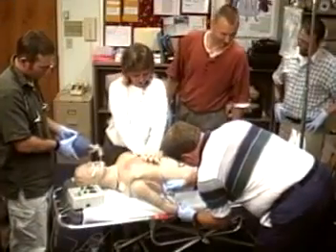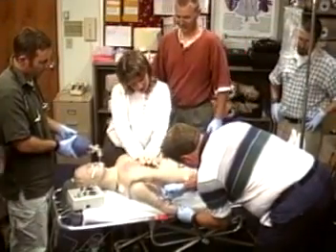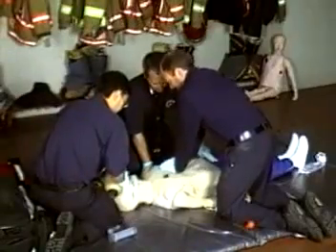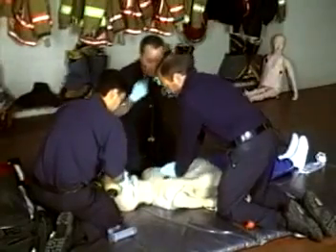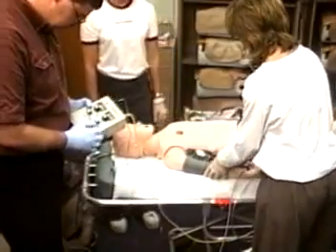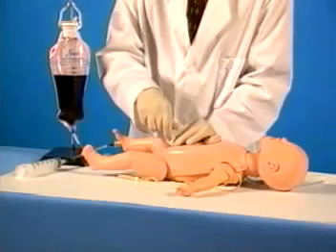We hope this video answered some of the questions you may have had about the LifeForm family of crisis mannequins. As you can see, each crisis mannequin is a complete training unit. They're designed to allow you to train in the same way you would work on a real patient.